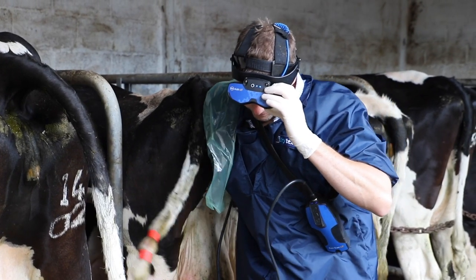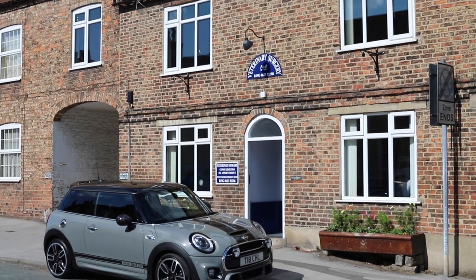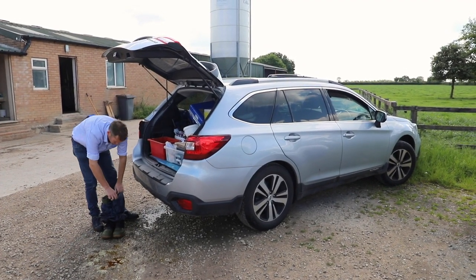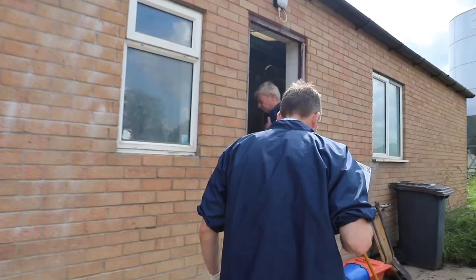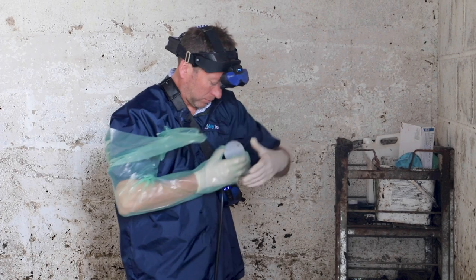We do a lot of pregnancy testing within the practice and our previous scanner was getting a little bit too cumbersome. Wires were beginning to get a bit irksome in these days of wireless technology, and the vascular pack was really huge and took ages to charge. When we saw this new device it just seemed to be a completely groundbreaking product, so it was hard to say no.